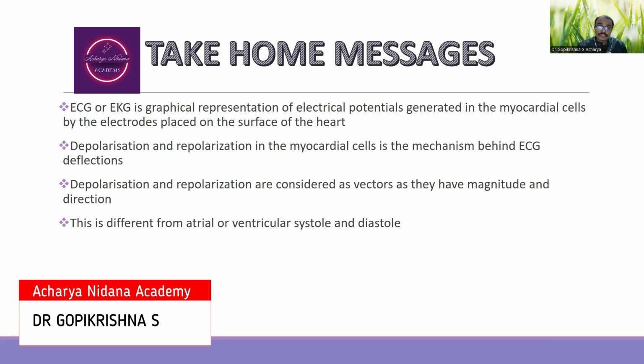They are considered vectors, as they have both magnitude as well as direction. Depolarization is not equal to atrial or ventricular systole, and repolarization is not equal to atrial or ventricular diastole. Atrial depolarization will be followed by atrial systole, ventricular depolarization will be followed by ventricular systole, and ventricular repolarization is followed by ventricular diastole.